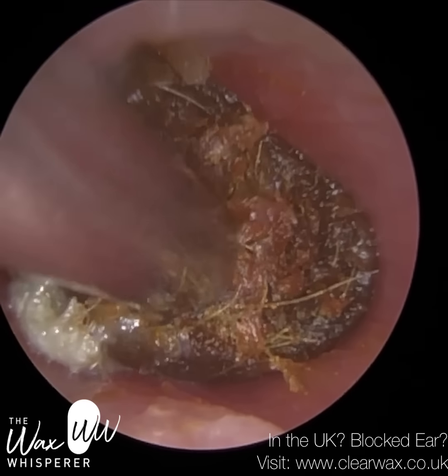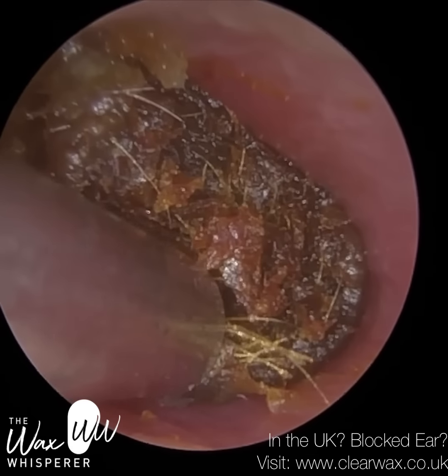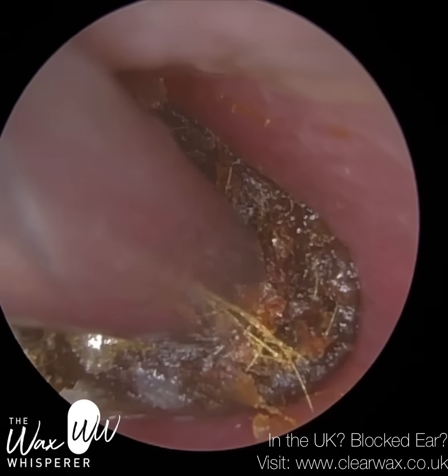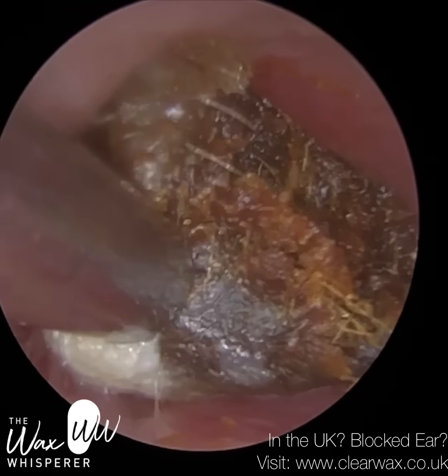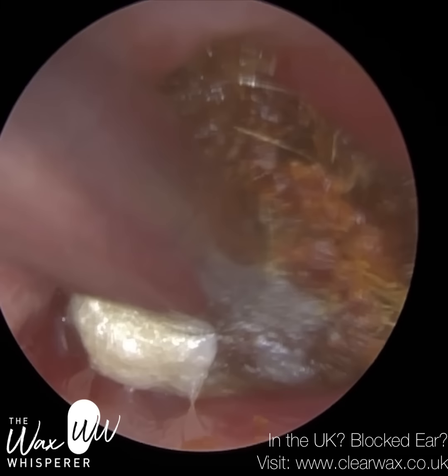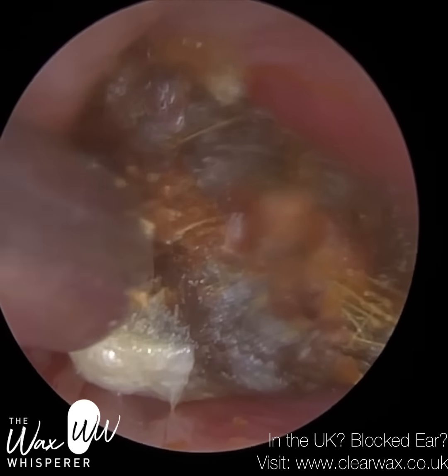Although it didn't come out, I did break it up in the middle. So what I'm now doing is the outer bits, I'm trying to peel it off the canal wall and push it to the centre. So I'm trying to almost change the shape of this chewing gum. I'm trying to make the size of the chewing gum smaller by bringing it into the middle, which then allows me to bring it through the ear canal.